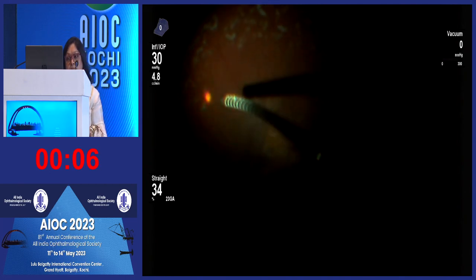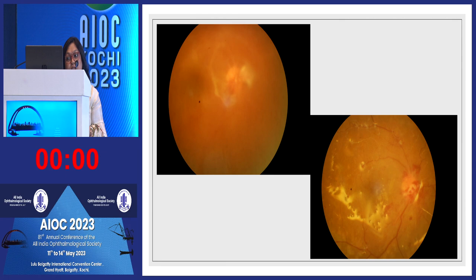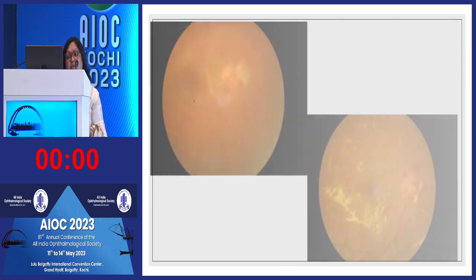Simple surgeries, but if done in a systematic way, I think you can achieve very good results for most of these patients. This was his other eye and the patient achieved 6/18 vision in both the eyes. Thank you so much.